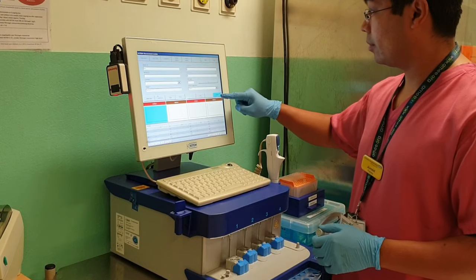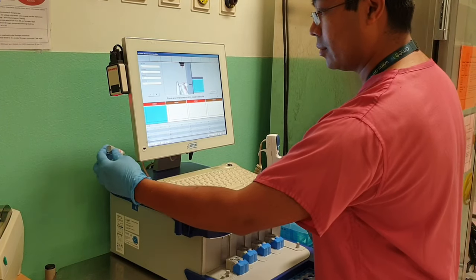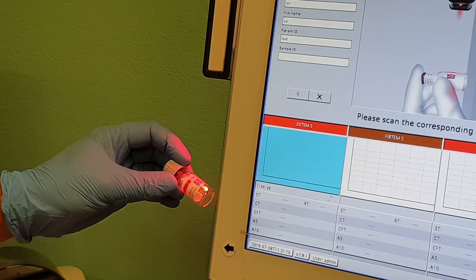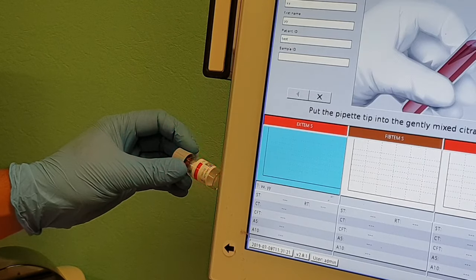Now you can start your run by pressing the start button. Get your reagent bottle — there's a QR code which needs to be scanned, and you should hear a beep when it is successfully scanned. The screen will then change.